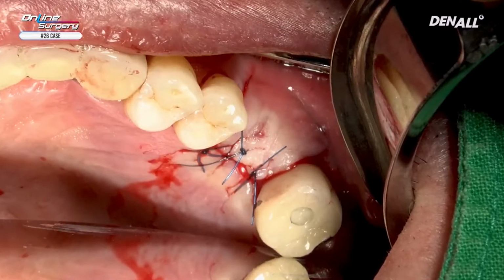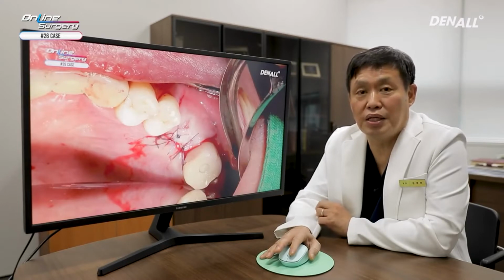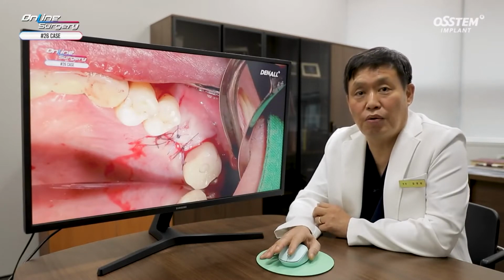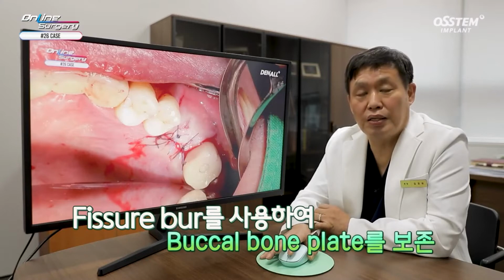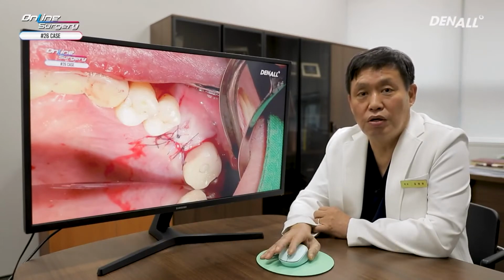In the case of this patient, fortunately, although there was a fractured implant, it was buccally inclined, and after implant removal, I was able to place the implant immediately because there was palatal bone. As shown in the video clip, while I was removing the implant, I tried my best to avoid damaging the buccal wall. I did not use a trephine bur, I used a fissure bur and utilized a fulcrum on the mesiodistal and a little bit of palatal side. Minimum bone prep was done only to the level that the elevator can go in to gain a fulcrum. Because there was quite a bit of palatal wall, I was able to place the implant immediately.